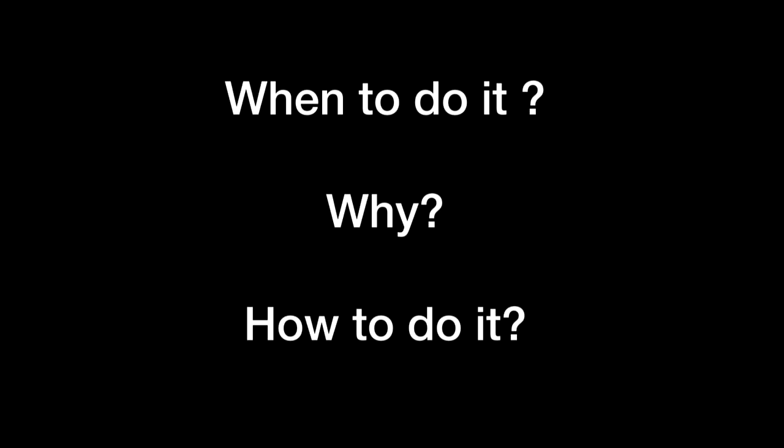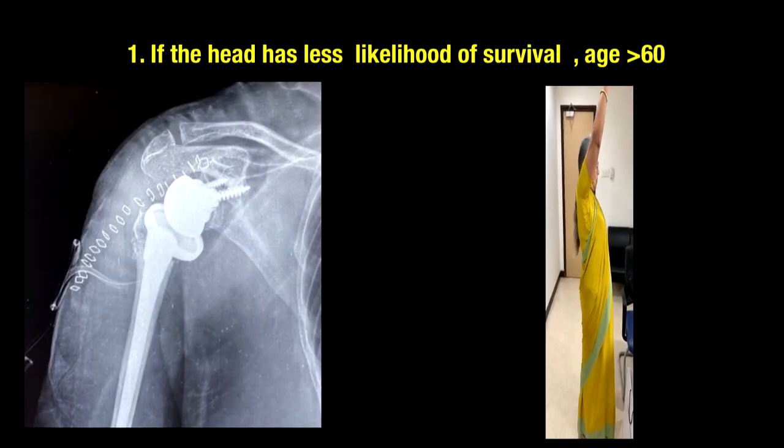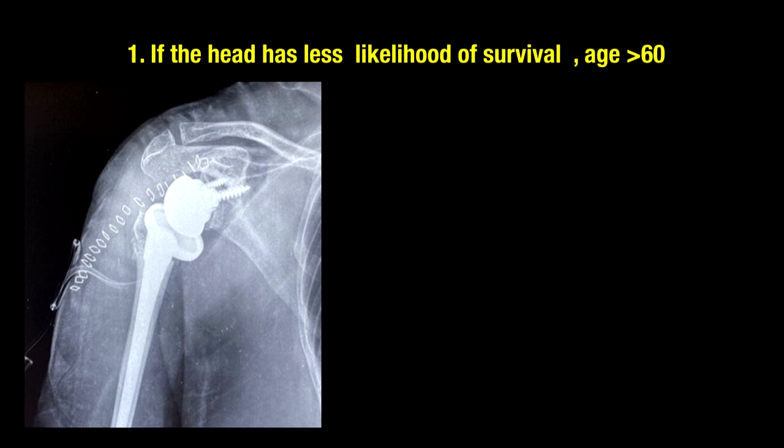And when to do it, why and how to do it, I'll give you three indications where you should do it. And all those indications are examples where you cannot probably conserve them and probably cannot plate them, at least I cannot plate them and give good results. So this is one. So head is dislocated in an elderly individual. There is no soft tissue attached mostly. And if you see, I cannot get the head back to the glenoid without stripping the soft tissue. There are sometimes in a dislocated fracture where I can. In this one, this is too far displaced and dislocated. I cannot bring it back. So this is one classic example where I would do a reverse shoulder, not hemi.